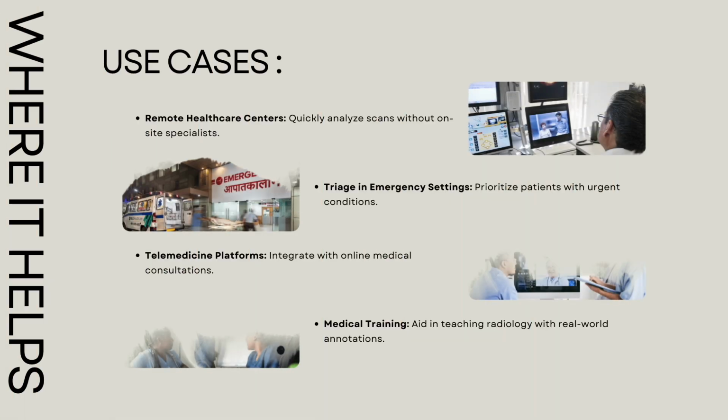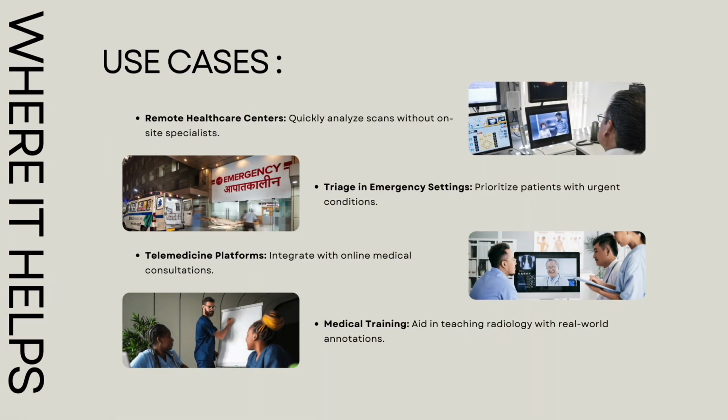Now let us talk about where this app can be used. First, it is perfect for resource-limited areas where access to medical professionals and diagnostic tools is scarce. It can also act as a second opinion tool for doctors, helping them make faster and more accurate decisions. And in emergencies, it can save precious time by delivering instant results and can guide life-saving interventions. It can also be used as a guide for medical students who are studying how to read X-rays. This can be used as a guide for them too.